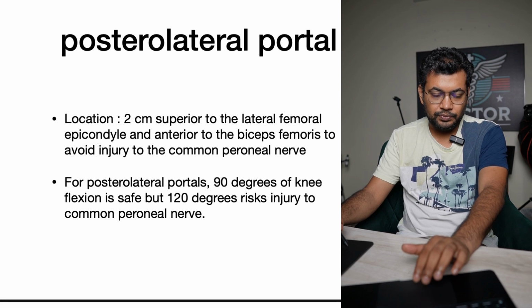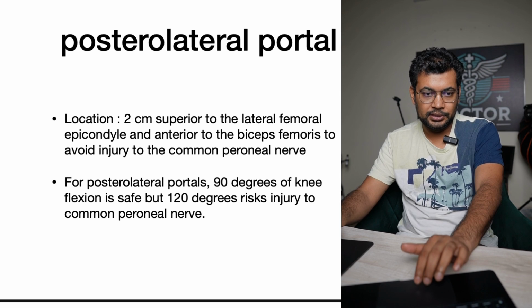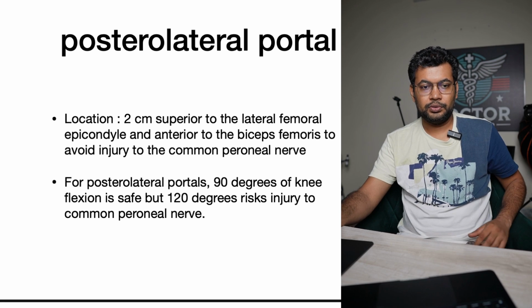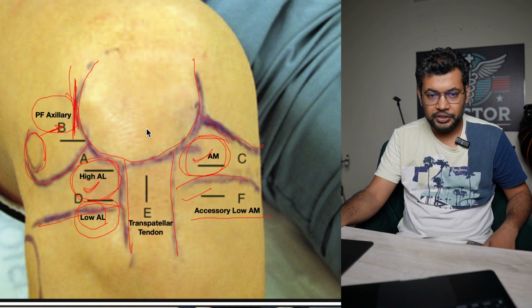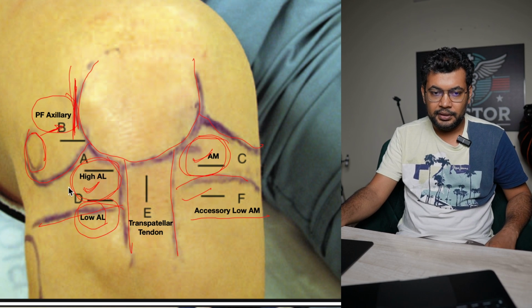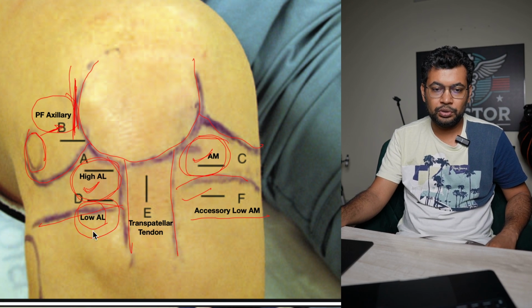To summarize this, let's have a look at the image in the first video. So this is our first slide. So again we first mark the landmarks, then we create an anterolateral portal, we do the diagnostic scopy, then the anteromedial portal. These are the two most common portals that we use. The other portals that we should know are the low anterolateral, low accessory anteromedial, and the patellofemoral axillary portal.